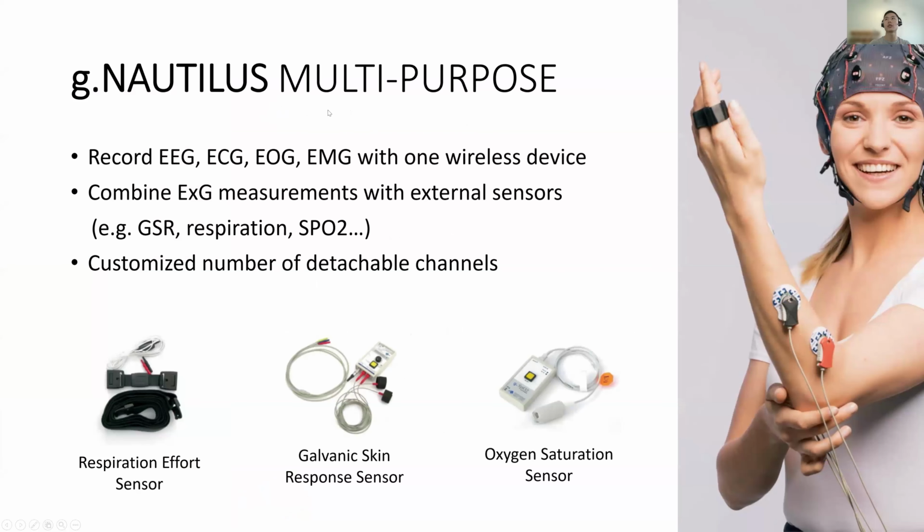This is the multi-purpose device I just talked about. It allows you to connect with different types of sensors too, which fits with today's topic. One example you see in this picture is this lady attaching GSR sensors on her fingers for detecting the sweat from her fingers, which in a psychological sense is how nervous or excited she is.